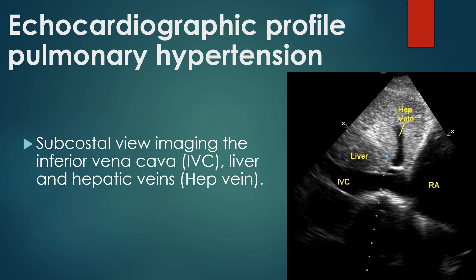Subcostal view imaging the inferior vena cava, liver, and hepatic veins. The inferior vena cava was dilated and showed little collapse with inspiration, known as IVC plethora, indicating high venous pressure. Normally, the respiratory variation in IVC size is more than 50%, with inspiratory collapse expected.